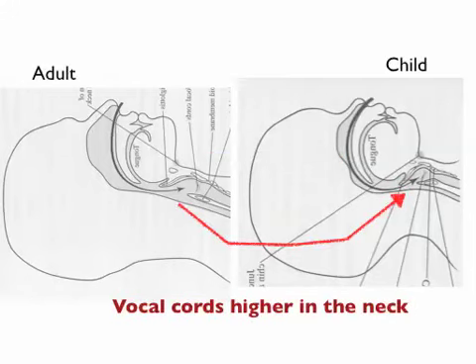And then also the opening to the airway, the larynx in the neck, where we're trying to get the endotracheal tube, is at a relatively higher position in the neck, and also a bit more forward. It's tucked up and under the tongue, so it's really a steeper angle to get around the back of the tongue and then forward into the airway, whereas in a lot of adults it's more of a gentle, smoother curve with the opening a bit further down the neck and not so far forward.